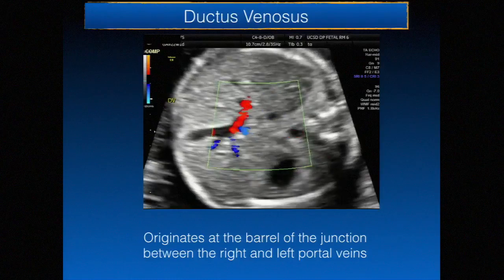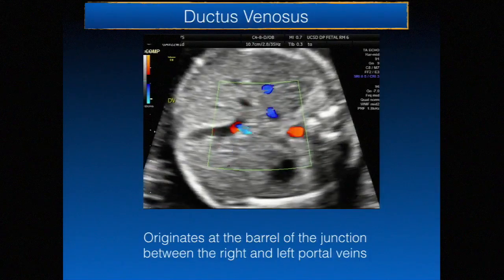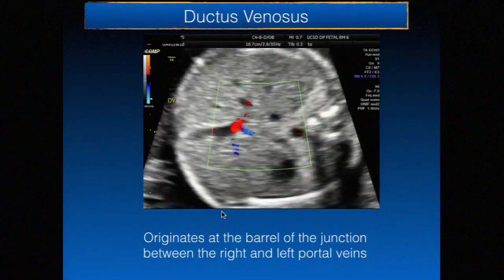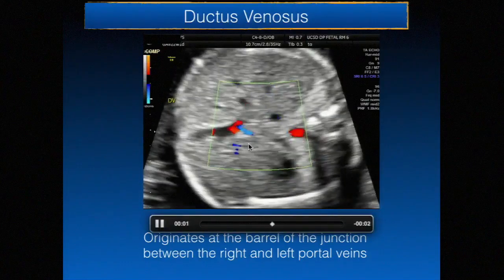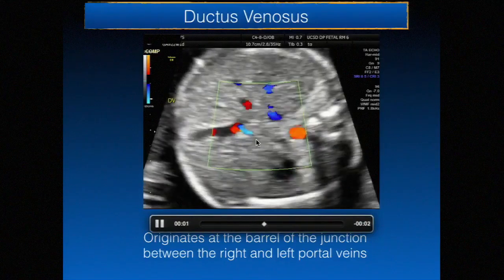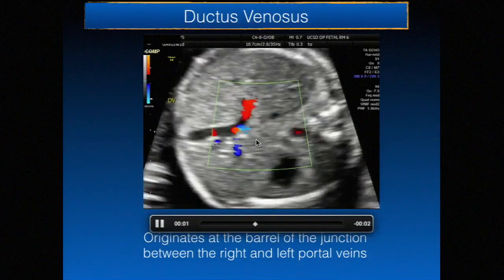Your ductus venosus Doppler does take a little bit of extra effort to learn how to do this quickly, particularly for the pediatric sonographers who aren't as familiar with this. But again, just be very familiar with the normal location. You can use the turbulence as a guide as well, but in cases where I've had absence of the ductus venosus that hasn't been draining directly into the IVC, or I don't have right heart enlargement, sometimes it's not there and there's an intrahepatic connection, so you might not see clues to that. So feeling very comfortable with the location, you can say there is absence of the ductus venosus with confidence because you know where it should be.